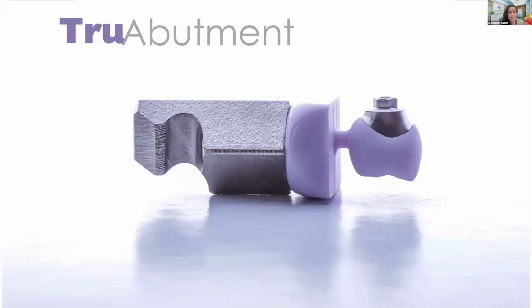Absolutely. Yeah. So the other thing about milling is the ability to do our implant restorations, one, in a very timely fashion. And I'm talking about TruAbutment. There are other labs that do this. TruAbutment just happens to be the one that I use. TruAbutment is a digital lab that will create basically custom abutments for you off your intraoral scans. And if you have a mill, you can actually mill the crown from their design. So they will design the crown for you. For me, with the Planmeca mill, I can put it into the mill because it's an open milling system and mill that design that they've created for me. They then send me back the custom abutment, and I marry those two together and deliver it in the mouth. And I can turn these cases around in about a week to 10 days. For a custom abutment from the laboratory, it would take at least a month.